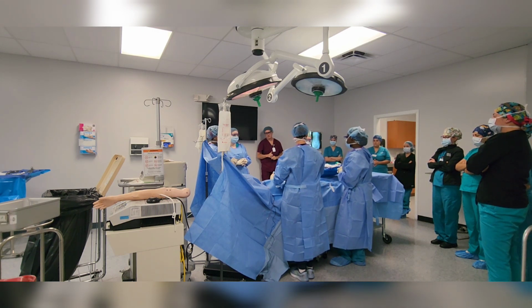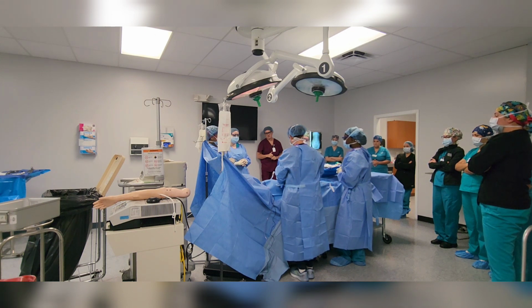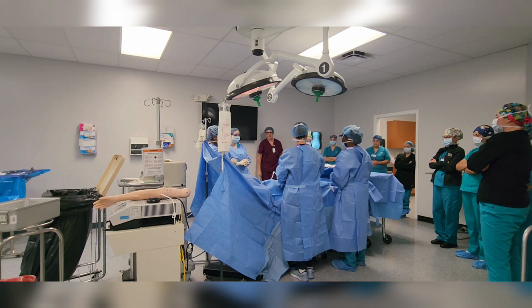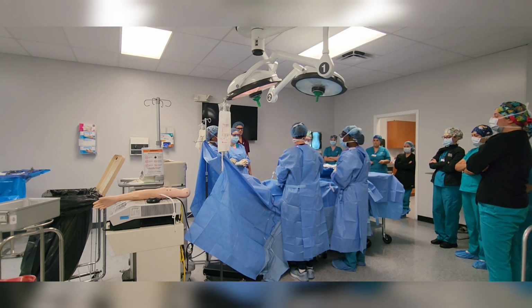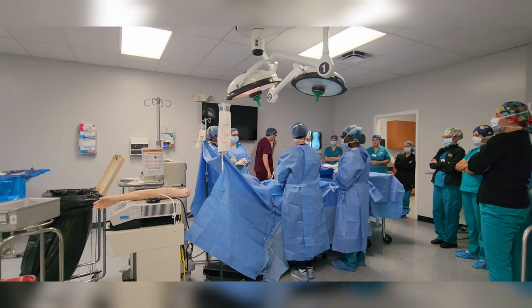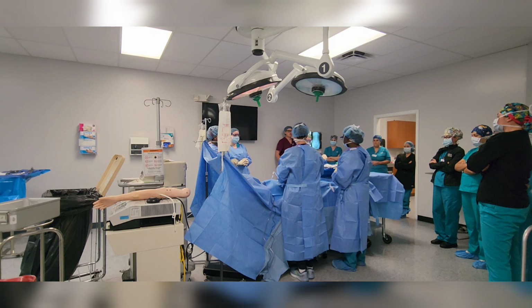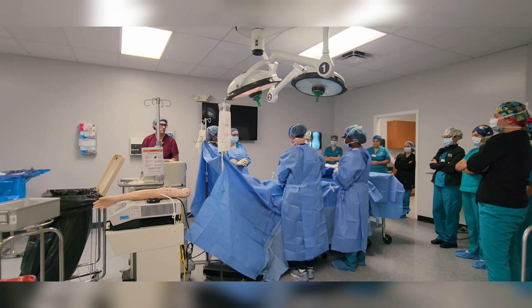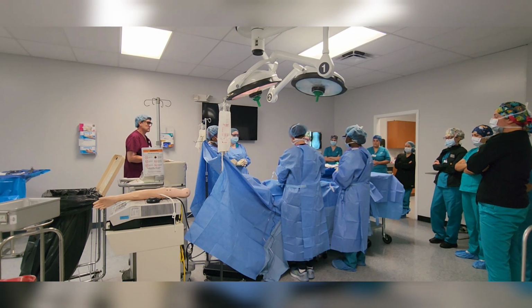Marker. So they would mark their incision site. What's next? There you go. What is it? Inject them with xylocaine 1%. Okay. So get the next thing ready. Set it right back on your field. You can always cap it once you hand the blade. There you go. Okay, get the next thing ready.